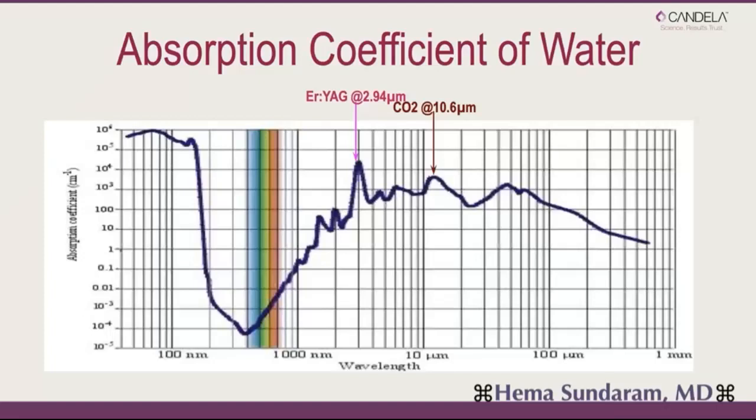We can look here at the wavelength of light and the absorption coefficient, and see that CO2 laser resurfacing has an absorption coefficient at a peak for water, just as erbium does. Always with lasers, the principle here is selective photothermolysis. We are targeting a specific chromophore, and for laser resurfacing, that chromophore is water, because there is so much water in the tissues we are targeting within the skin.